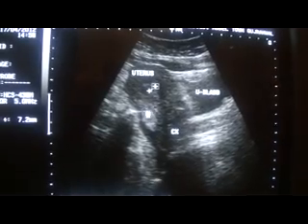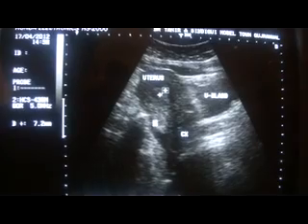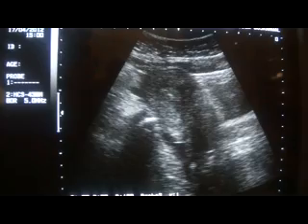So this patient is suffering from pelvic inflammatory disease. This is fluid. The rest of the uterus is normal. Fluid is not seen above the area where we are seeing fluid. So this is the fluid in the pelvic cavity — here it is in the pouch. This is a case of pelvic inflammatory disease.